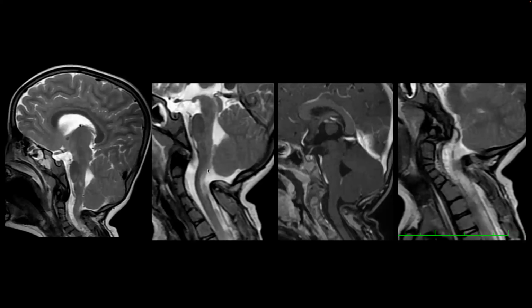If it was only an infarct, these diffusion changes would not be there, the cervicomedullary changes, the medullary changes. If it was only an infarct there, there would not be these additional edematous changes. CSF was absolutely normal, and the child didn't have any clinical features suggestive of cord involvement. By the next day, the child was all good, and sensorium was also good.